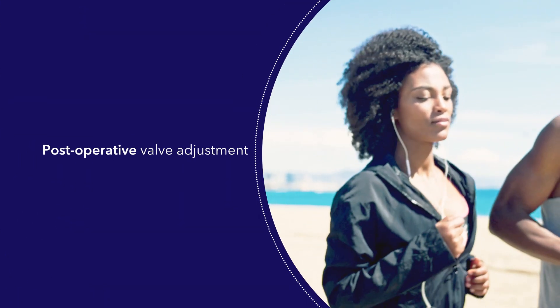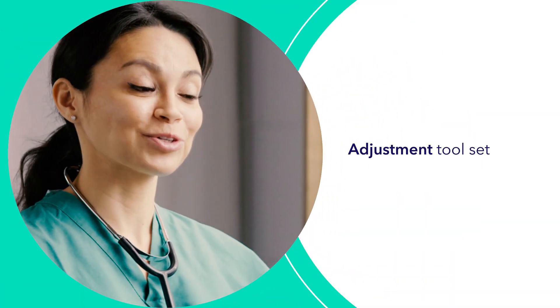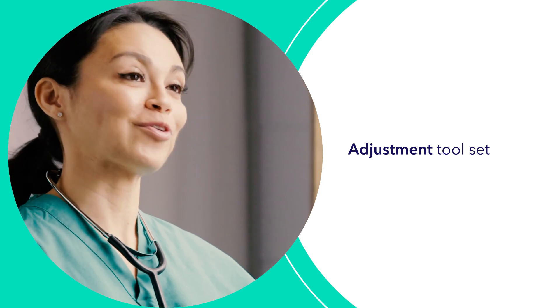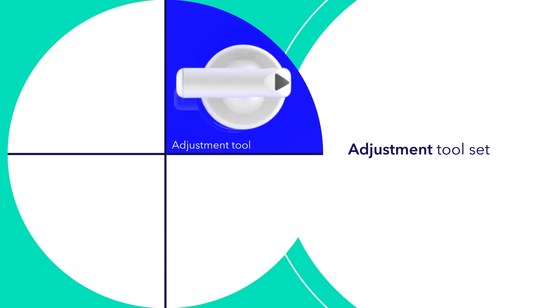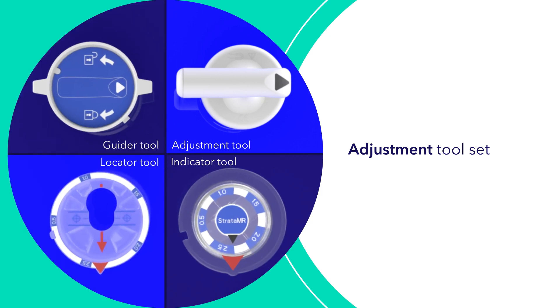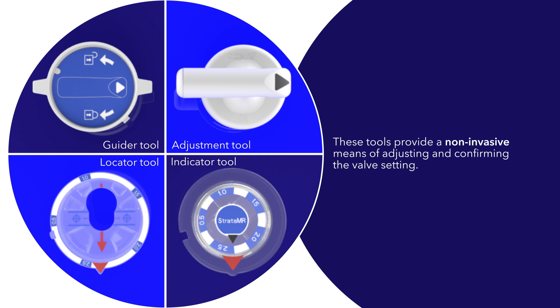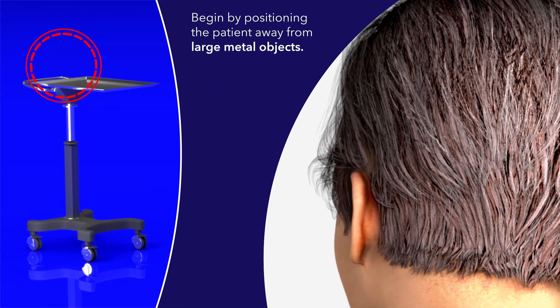The following segment shows the procedure for post-operative valve adjustment as detailed in the instructions for use. The Strata MR2 adjustable valve system includes an adjustment tool set which consists of an adjustment tool, an indicator tool, a locator tool, and a guider tool. These tools provide a non-invasive means of adjusting and confirming the valve setting.